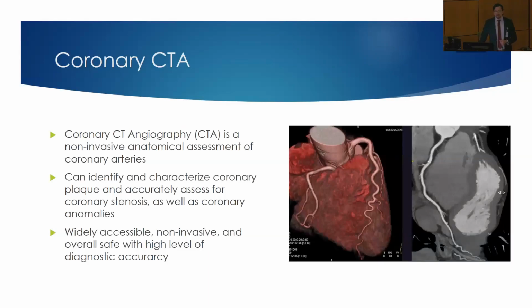So jumping into coronary CT. What's neat about coronary CT is that it's a full anatomical assessment of the coronary arteries. It's completely non-invasive. Just think of it like getting a heart cath, an invasive angiogram, but completely non-invasively. And we can do some cool post-processing to show how the anatomy is. We can go into the vessel itself, some 3D post-processing. Really neat, powerful tools that we have.